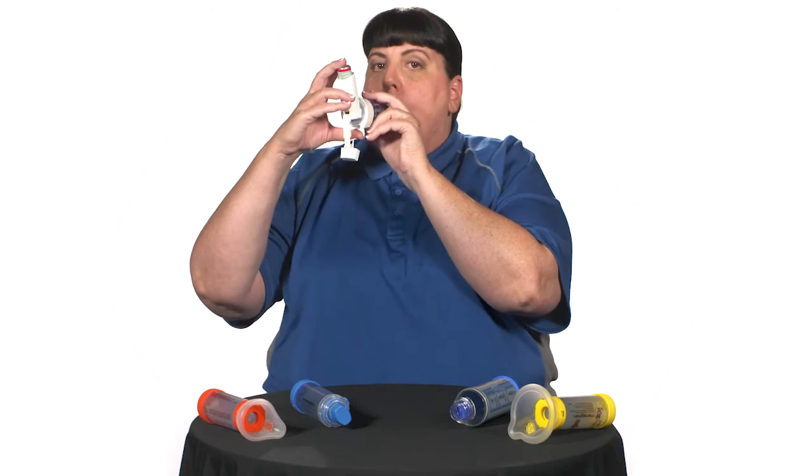After you breathe in slowly, take it away from your mouth, close your lips and hold your breath as long as you can while blinking up to 10 times very slowly, or counting to 10 in your head or on your fingers, but not out loud. When you can't hold your breath any longer, then breathe out. If you breathe in too fast, some, but not all of the spacers whistle and tell you that you're breathing in too fast. So slow it down so you don't hear the whistle like this. So that whistle means you're breathing in too fast, so slow it down.